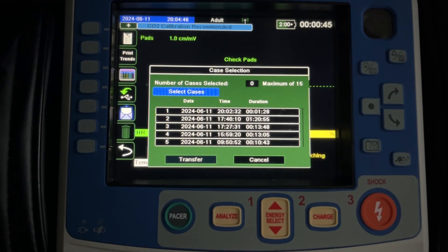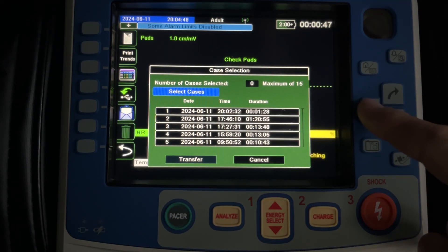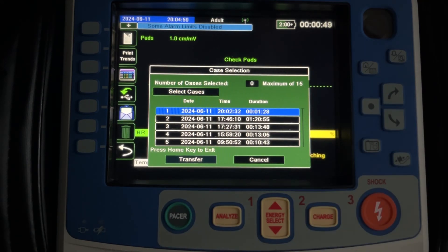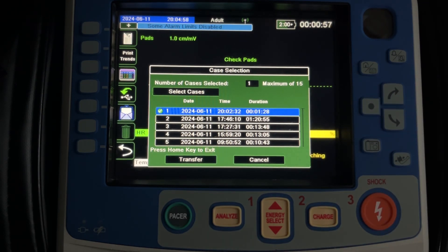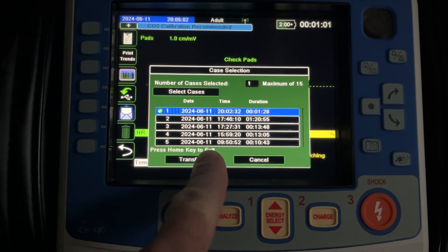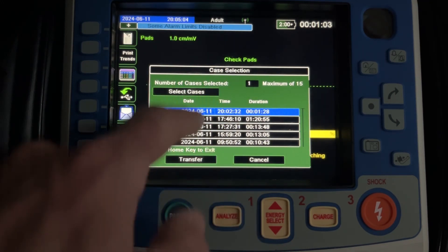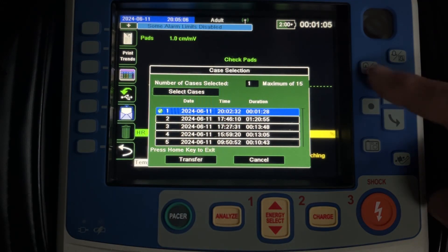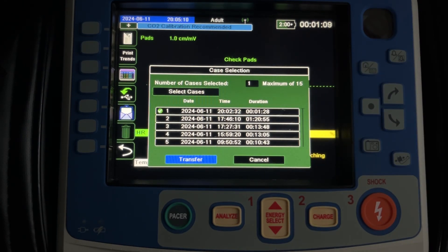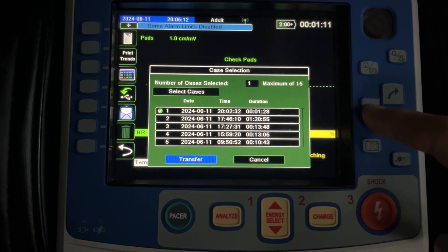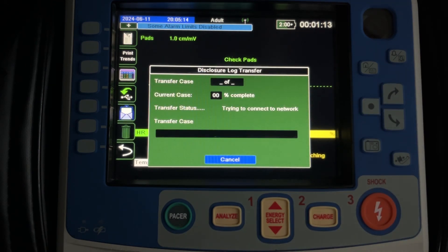Select Cases is highlighted, so I'm going to hit that dot enter button on the right side. It's going to pull me down into the list of calls that are available. I'm going to select the one that I want. Then it says press home key to exit, and what you're exiting is the selection criteria. I'm going to hit the home key, which is a button right here. It's going to highlight Transfer, and then I'm going to hit the little dot again to make the selection to transfer it.